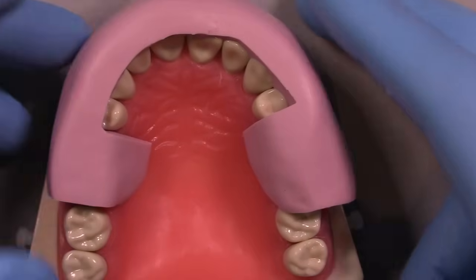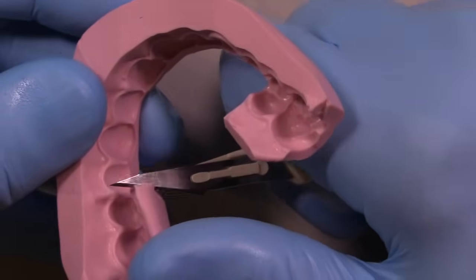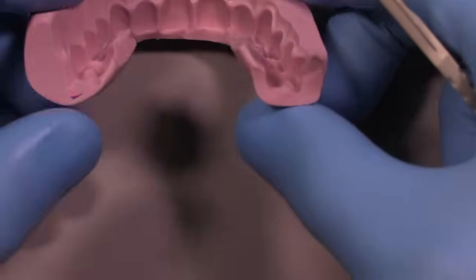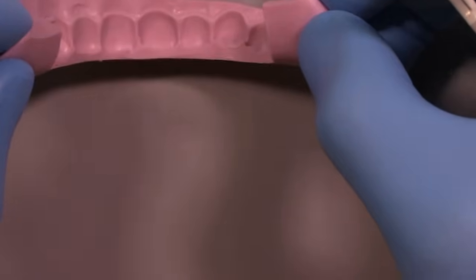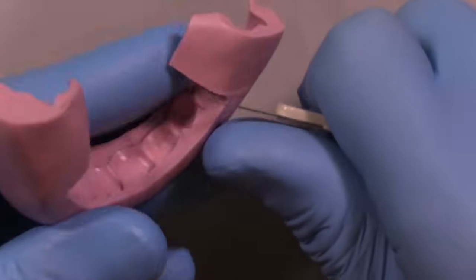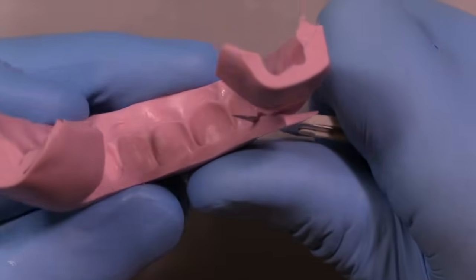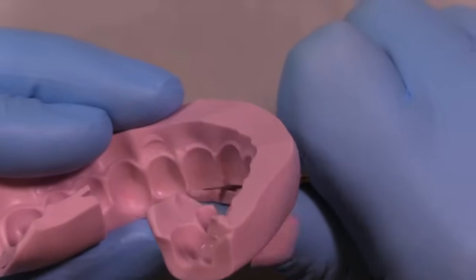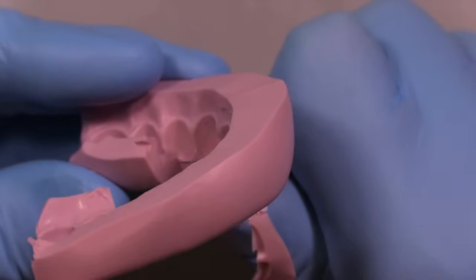This is how the stent initially fits on the model — it would be made off of a diagnostic wax-up or the duplicate of a diagnostic wax-up. What I'm going to do now is just trim off some of the areas that are extending a little bit too far into the palate. The stent, if inserted with these long extensions, can initiate a gag reflex in your patients, so we'd like to avoid that. We want the guide to be stable and not too thin, yet thin enough to fit into the mouth easily. The next move is to shave away some of the incisal area so that you expose the incisal edges.